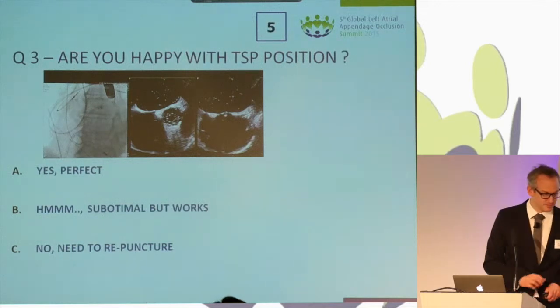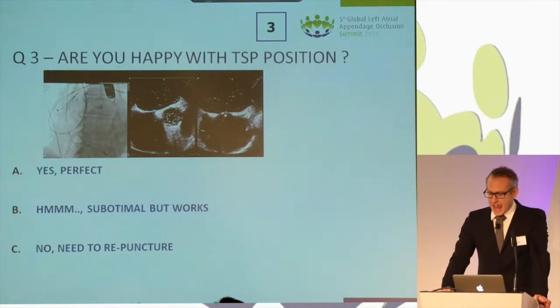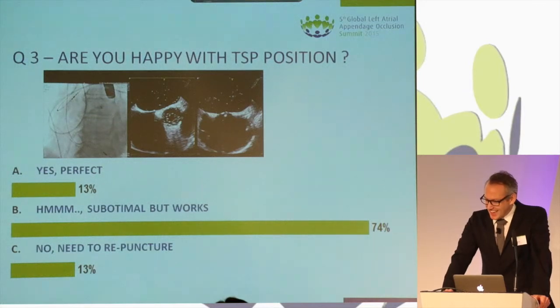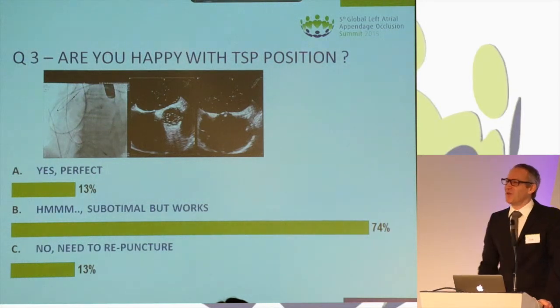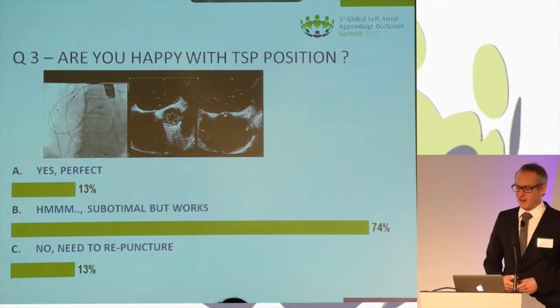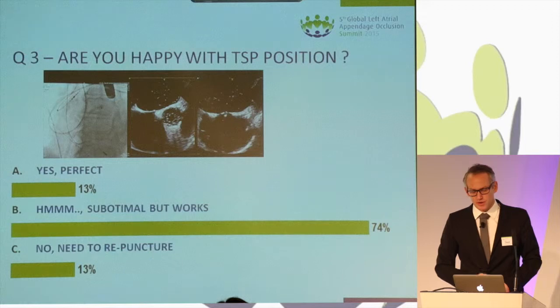Six seconds to go. Okay, 13%, it's perfect. Thank you very much. Most of you would stay in the left atrium and try it with this position, and a minority would repuncture.